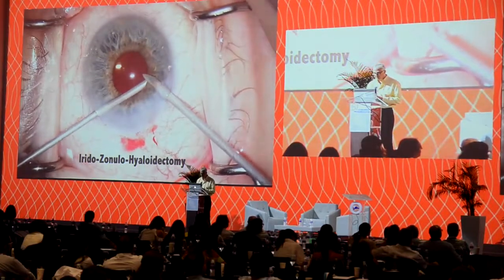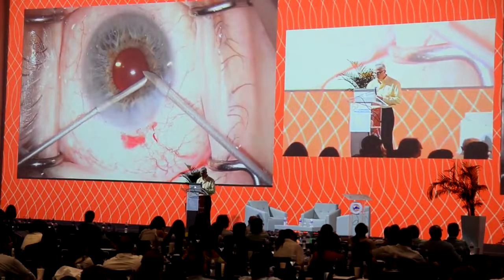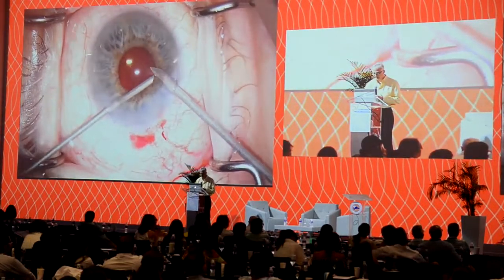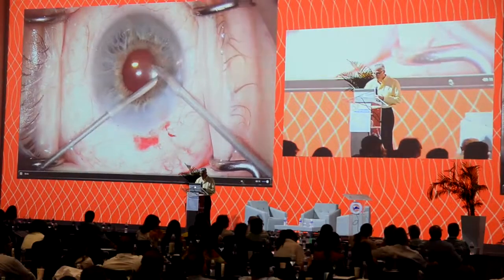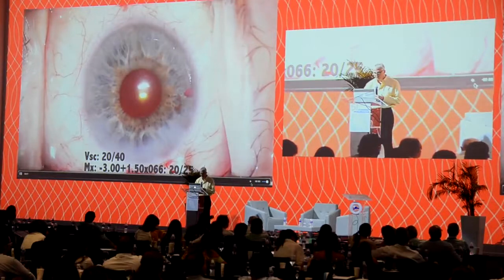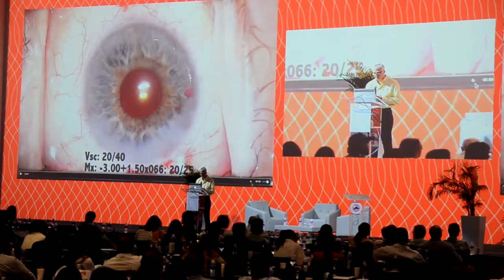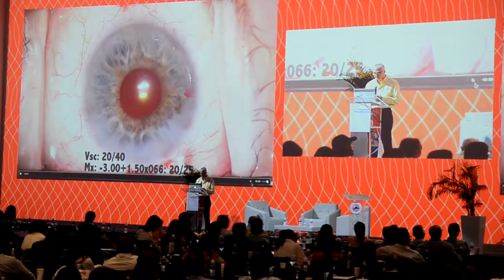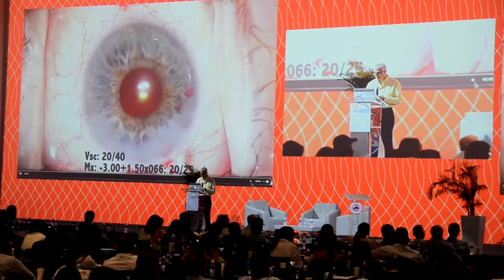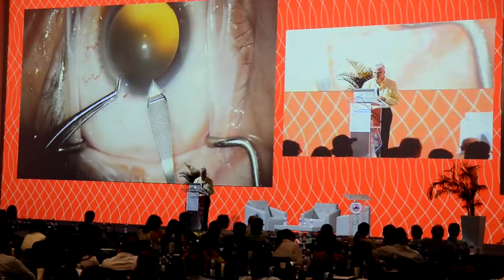I use a very slow cut rate and I create a nice little opening, and then I turn the vitrector down in the other direction, and we go through the zonules and take a little bit of vitreous in that space as well. And that really is a wonderful help. And this patient ended up 20/40 uncorrected, 20/25 with a different refractive error than you might guess for only a two-line difference. But these implant lenses actually do induce some spherical aberration because of their extra high powers, and in fact it sometimes gives them a better range of focus.